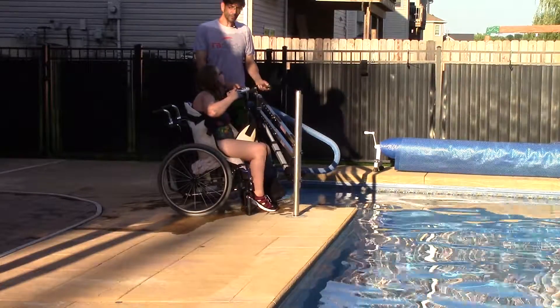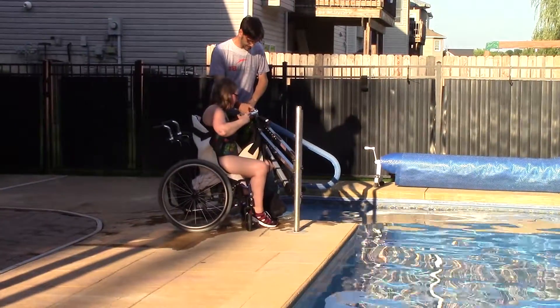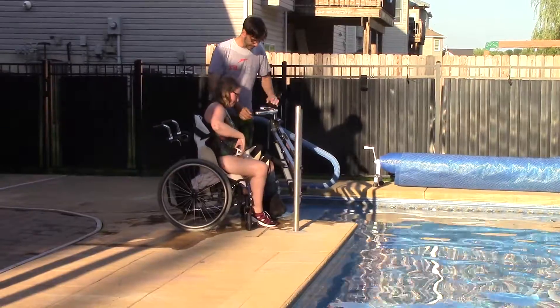Once we're all the way down, we release. And we're ready to get out for that ice cream.